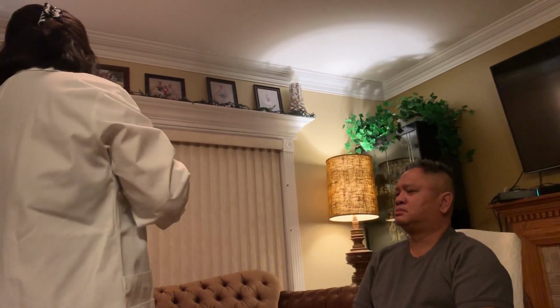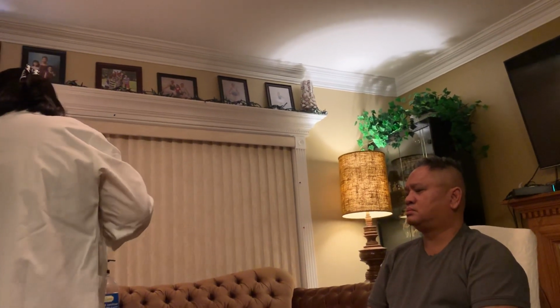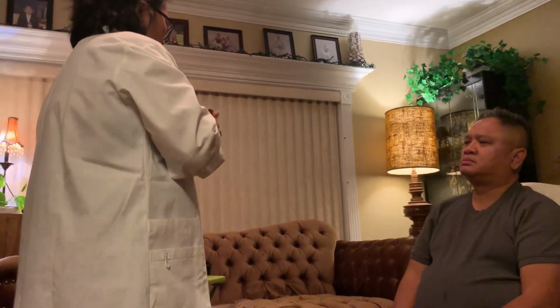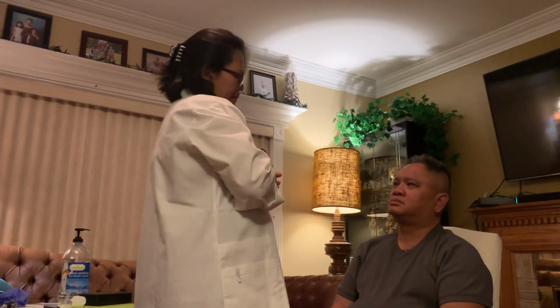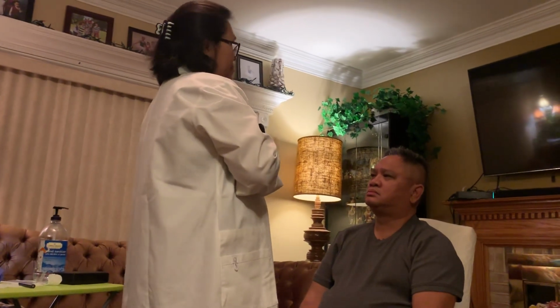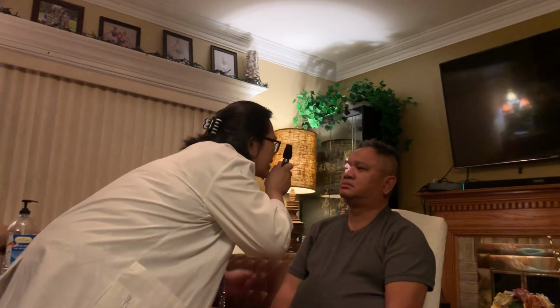So the next testing is I'm going to check the internal structure of your eyes, and I'm going to use the ophthalmoscope. So normally when doing the fundoscopic exam, it should be on a dim light. So I will use my right hand to test the right eye with a dim light. It's a little dim, so okay.